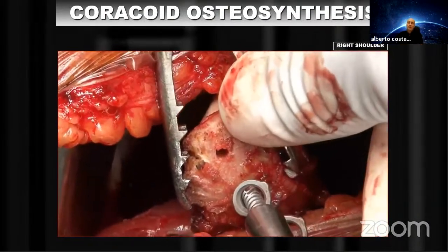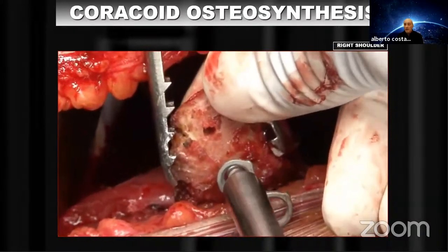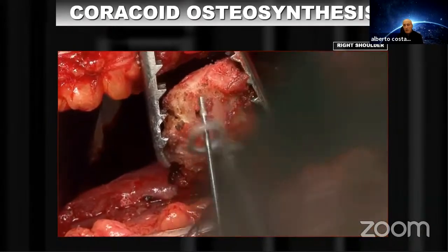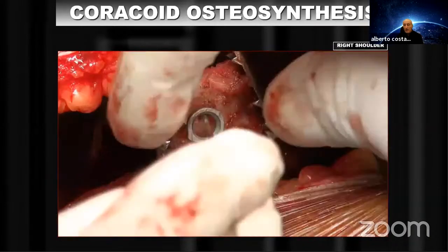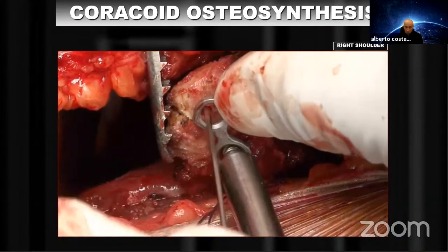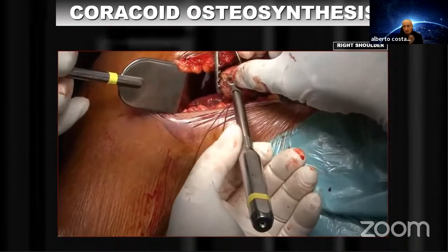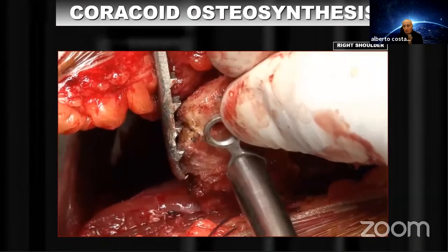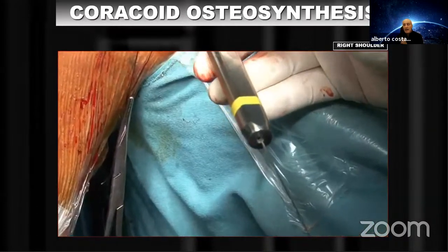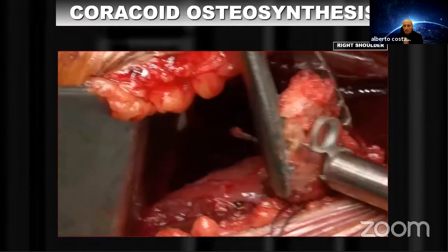We use this device that you see down here, and we call it the joystick. This device has two functions. One is to keep the glenoid, the graft, and the plate. The second device can push against the graft and the plate, and then we introduce a K wire.